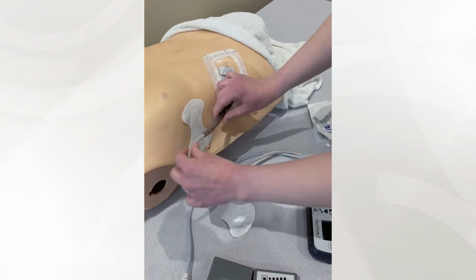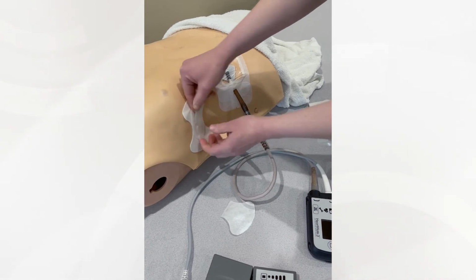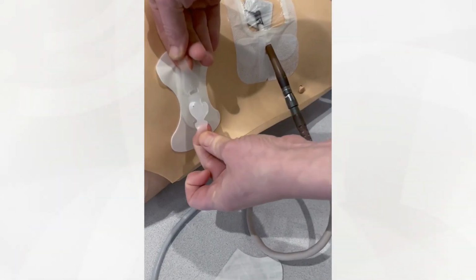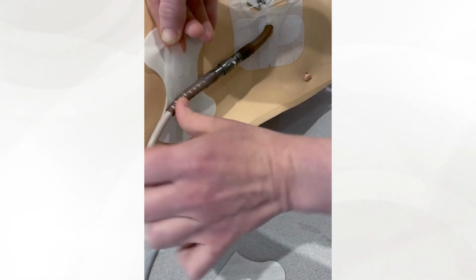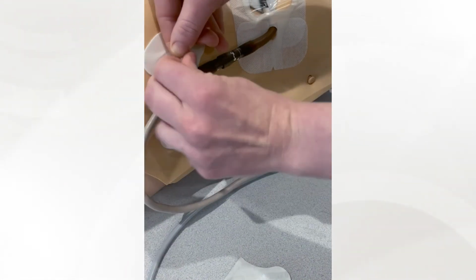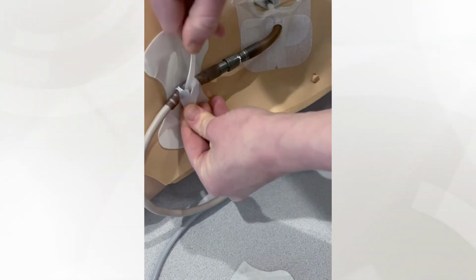You're then gonna bring your drive line, and on one end there's a hole, the other end has the thing that you're gonna push through, the little plastic piece. So you're gonna pull this plastic piece into this hole. Pull it all the way through until it pops through and catches.